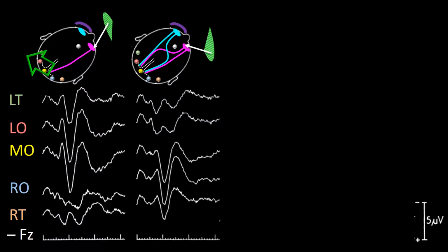So, right visual field stimulus of the right eye activates the nasal retina. Thus, the left eye is not activated because it is patched. Neither is the right eye temporal retina. Therefore, no pathways arise from it.